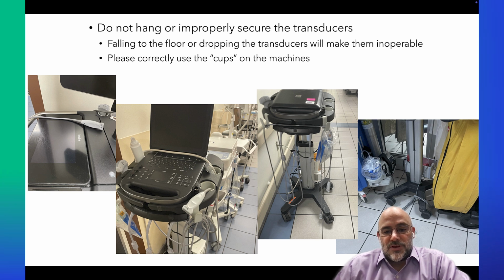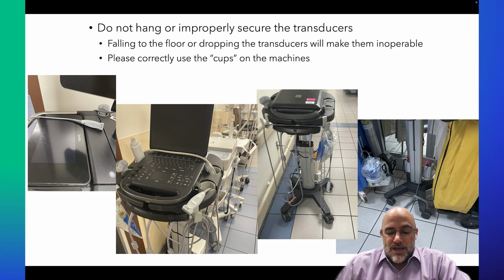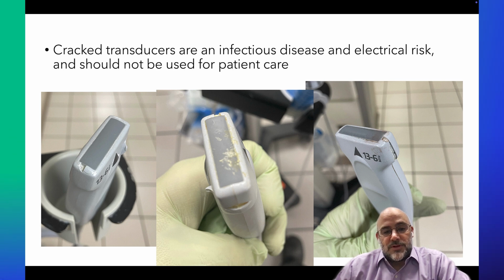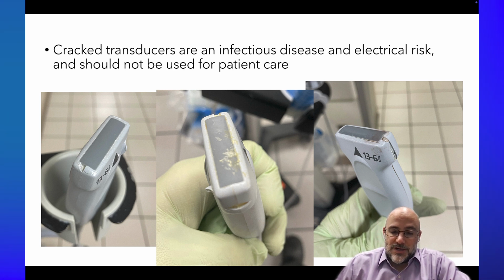So again, just to reiterate, remember to make sure that your transducers are secured, not falling to the ground, not at risk for falling to the ground, and that they're up in the cups designed to hold the expensive transducers, and the cords are up off the ground. Similarly, we want to try to avoid using cracked or broken transducers that are not watertight. There's unlikely to be a risk of electrical shock to the patient, but it's probably more likely that you can cause a short that will damage the machine itself and not just the transducer.